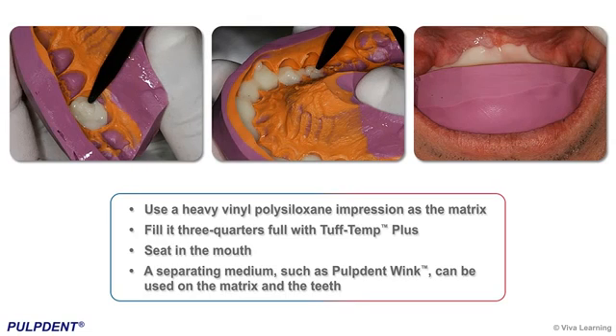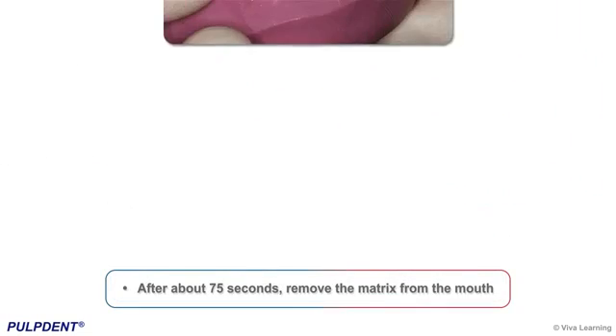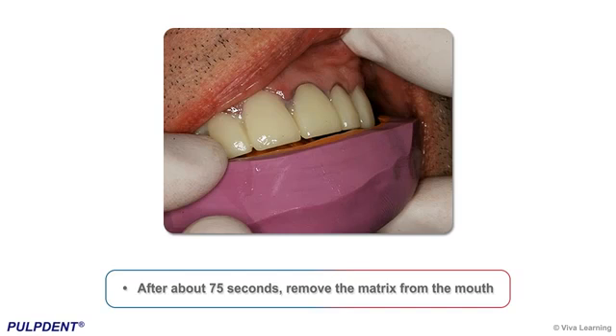To create a Tough Temp Plus provisional, use a heavy vinyl polysiloxane impression as the matrix, fill it three-quarters full with Tough Temp Plus, and seat it in the mouth. A separating medium, such as Pulp Dent Wink, can be used on the matrix and the teeth. After about 75 seconds, remove the matrix from the mouth.